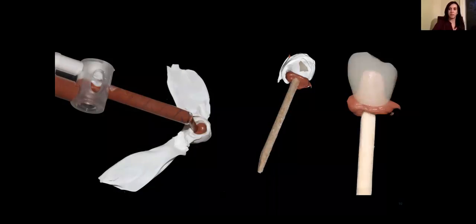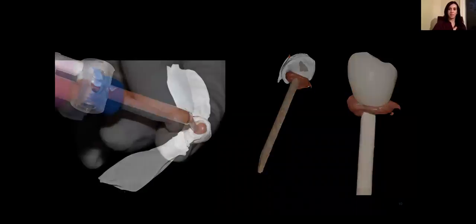So now you can see how nicely the crown fits on top of that duplicate abutment. And at this point, what we've done is we've delivered the abutments intraorally. We've tried in the crowns, making sure that your contacts, occlusion, everything is ideal prior to cementation. The abutments are torqued into place, and now we utilize this duplicate abutment in this fashion.